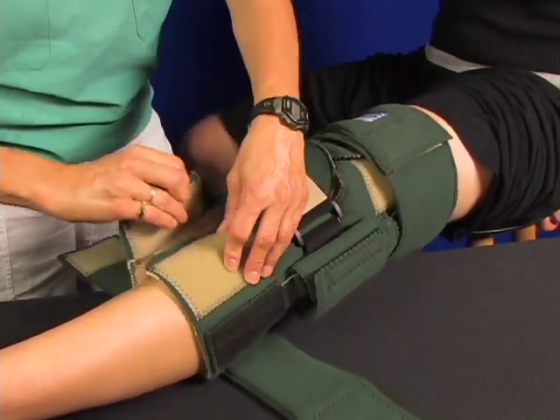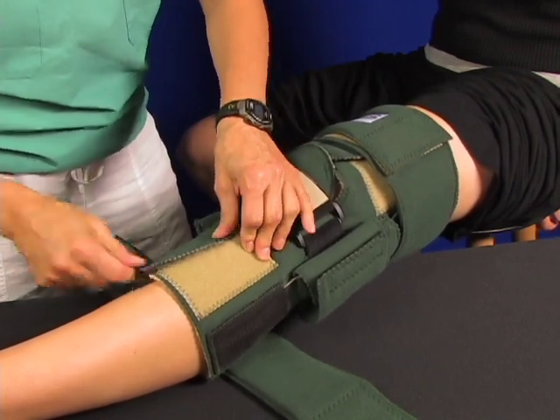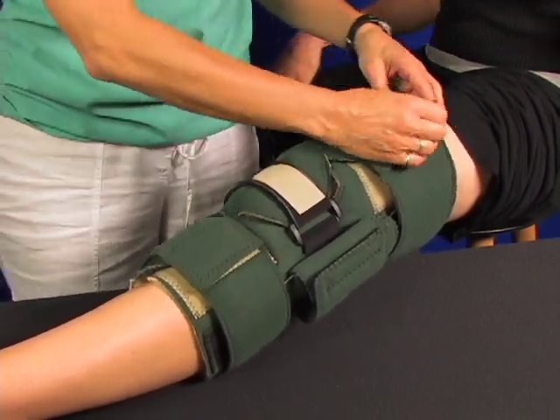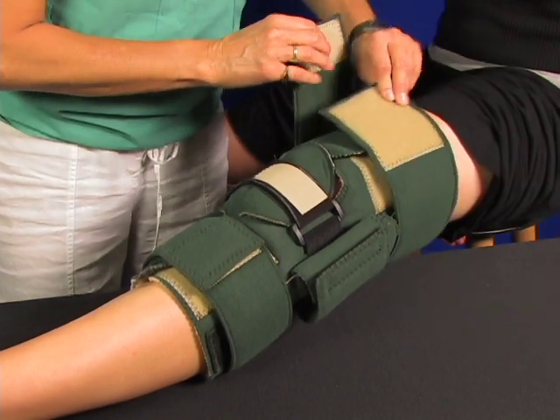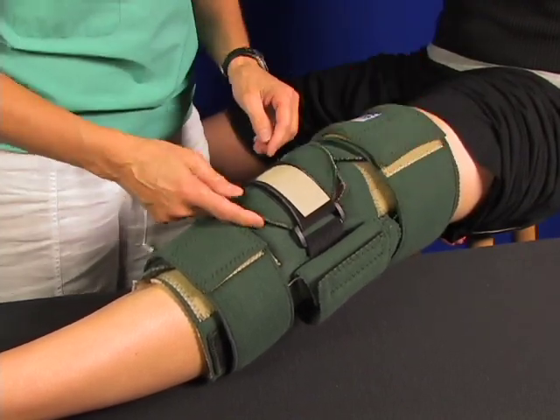Go back and check your fits. Make sure you're not too snug, and reapply the outer straps. Check your fits. Always check your fits. Make sure you've got your proper tension.